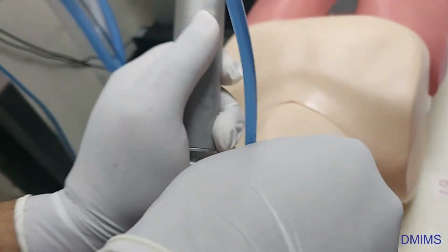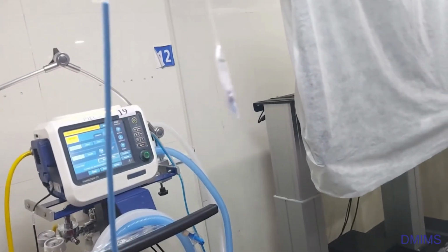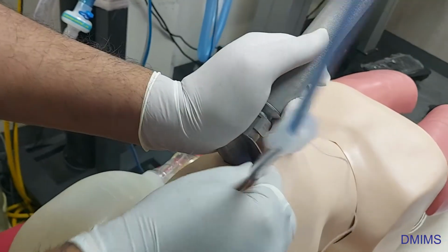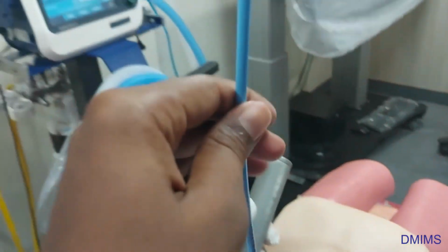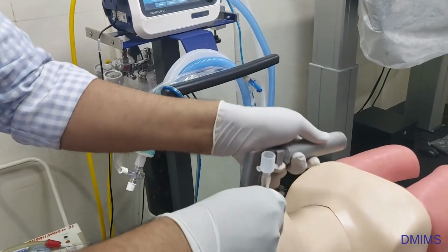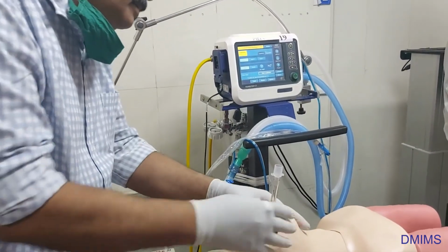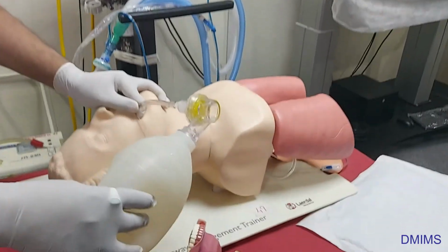Now load the tube, and railroad the tube over the bougie, passing the tube through the cords. Pull out the bougie, please. I think I'm in. Once I'm in, what you have to do is inflate the cuff, hold the tube, and see if you can ventilate.